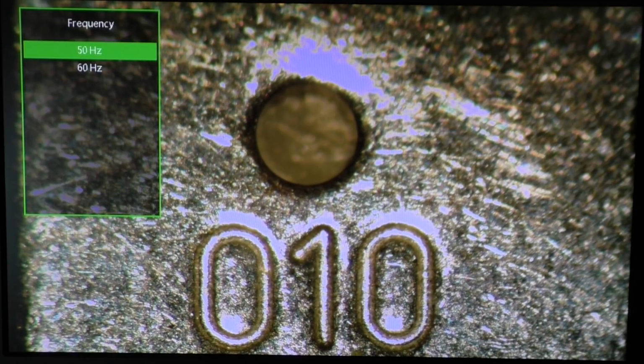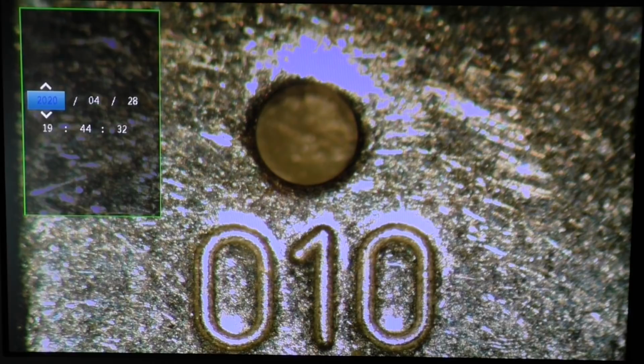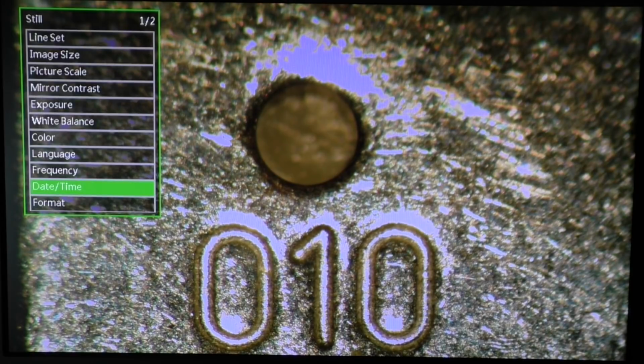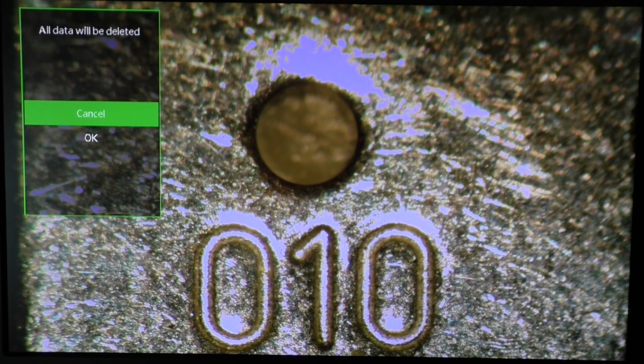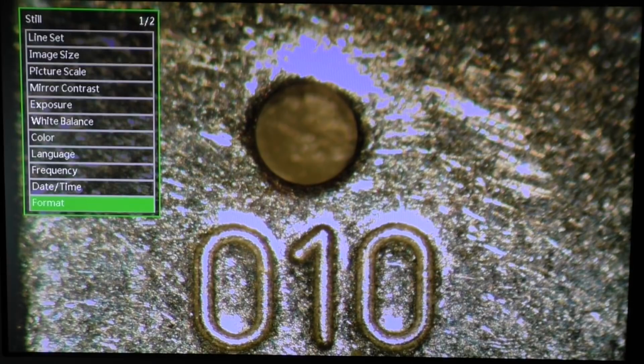50 or 60 Hertz. Well, maybe that's some flicker suppression. Don't know exactly. I mean, in the still image setting, the hertz doesn't make much sense except for the light. Yeah, that's probably to reduce flickering. Date and time, of course. Yes, we know how that works. And format the SD card. We can do that, and that's something you should do with a new card.